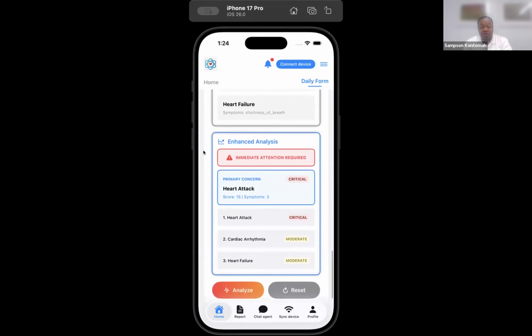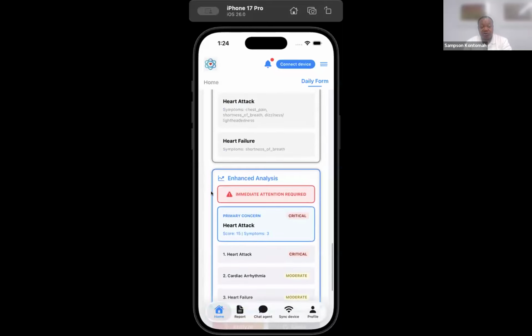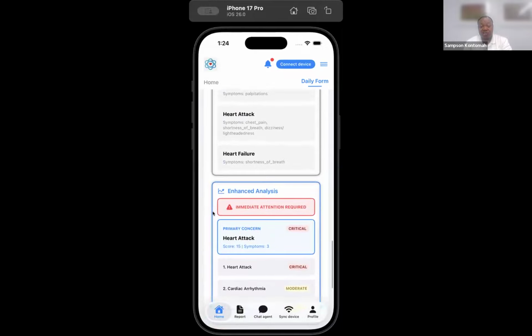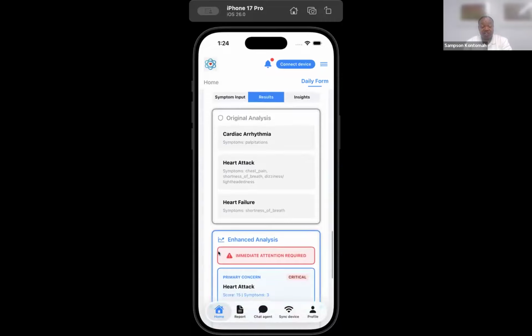It's a very useful tool for remote patient monitoring, and also for proactive measures by the treatment team, all done to improve quality of life, reduce mortality rate, and have better outcomes for patients. So I will end here and hand over back to Mahita to conclude the patient dashboard.